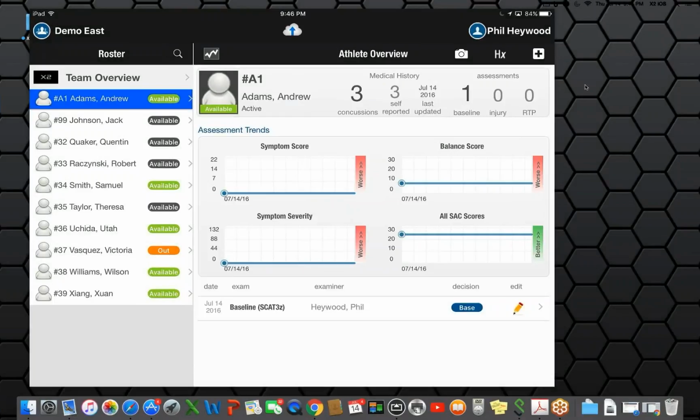Welcome to the X2 Biosystems Integrated Concussion Evaluation Training. Today we'll be going over the post-injury evaluation.